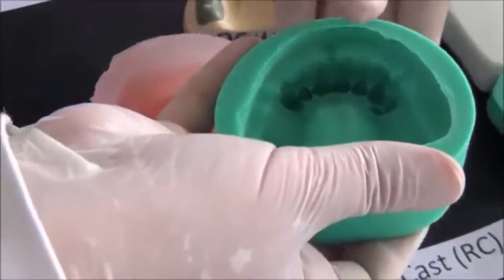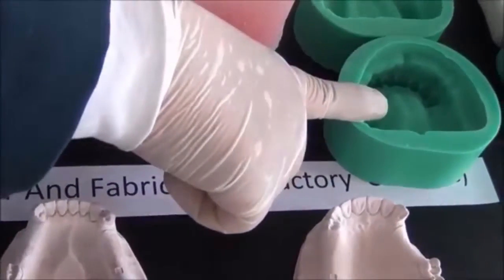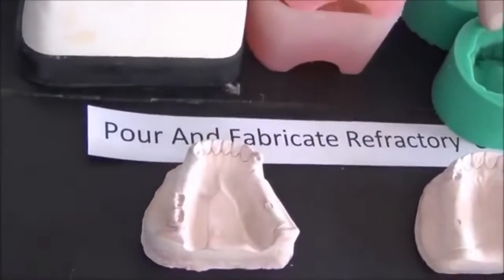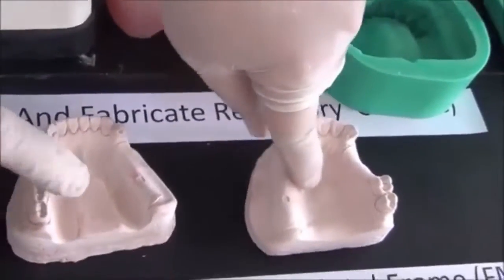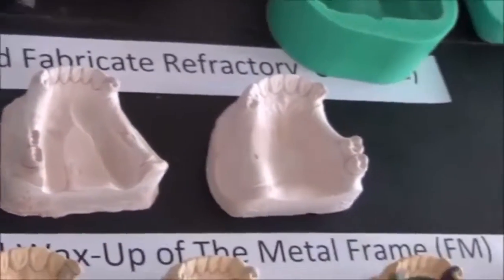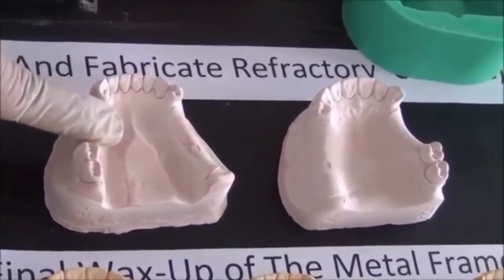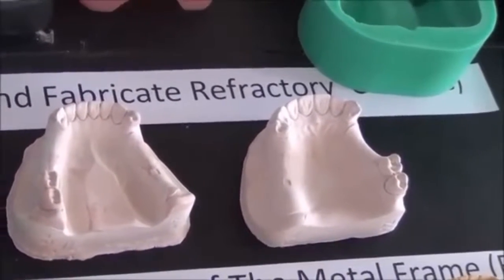This empty mold now is ready to be used as a form for pouring in the refractory material. The refractory material is another material, powder and liquid, mixed together. Once we pour it inside here, we will get these refractory casts. The main property of the refractory material is that it withstands high temperature, and it will compensate for the expansion and contraction of metal during the cooling process. Please review your dental material lectures and read your dental material chapters about refractory material.